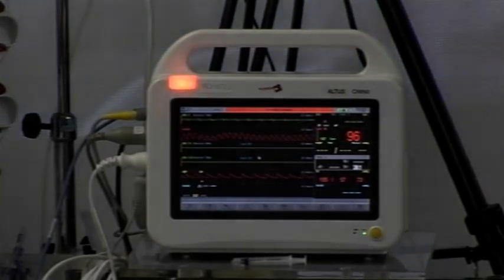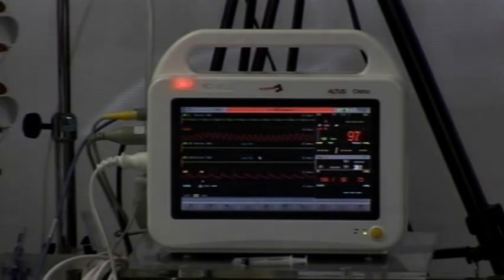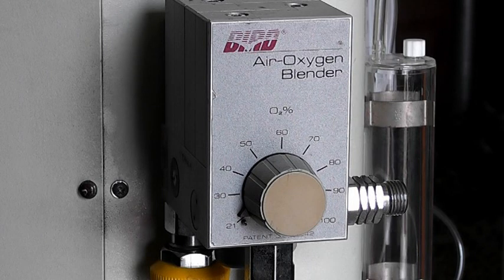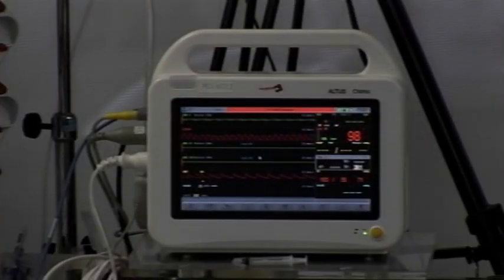Now, if it does happen, you just decrease your CDP by 2, 3, 4 centimeter of water, and you have to see an effect on your blood pressure. Otherwise, it's not your CDP. I hear too often people saying, yes, but I have blood pressure problem with my high CDP. Forget it. It's not the reason. As long as you don't prove it by challenging the blood pressure, decreasing CDP, you will not convince me.